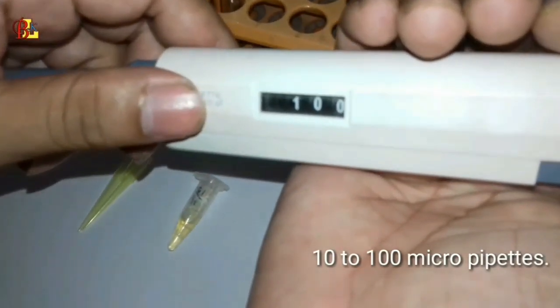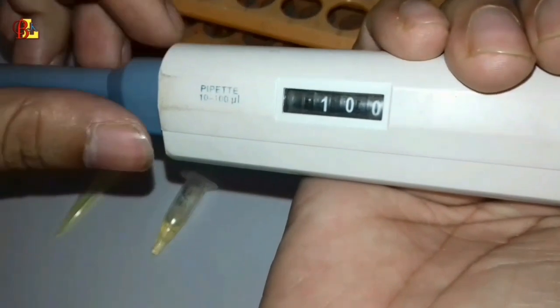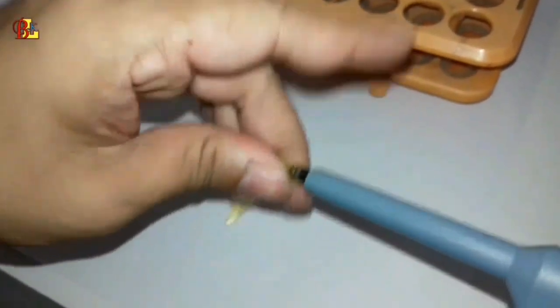The micro pipette now in my hand is a 10 to 100 micro pipette. With this pipette, 100 microlitres of serum should be taken and added to this test tube.